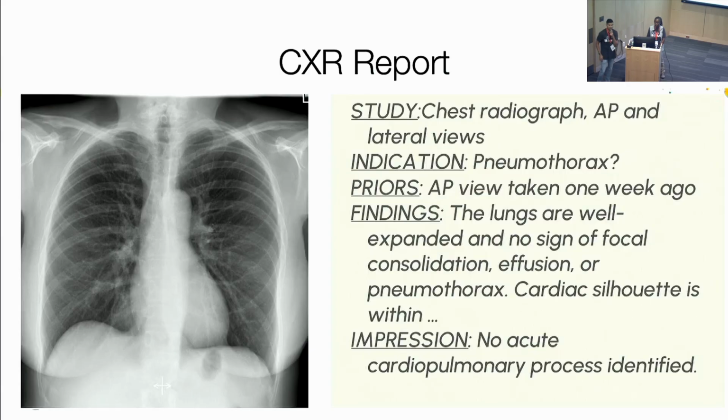Okay, so that's a very good point. What he said is that different radiologists or healthcare practitioners may label the same image with different labels. Judy may think it's a pneumothorax and I may not think it's a pneumothorax. That's a separate issue, right? It's like what are we actually calling ground truth? It's actually just somebody's opinion. That won't change between the findings and impression section of a single report, because it's generated by one person.